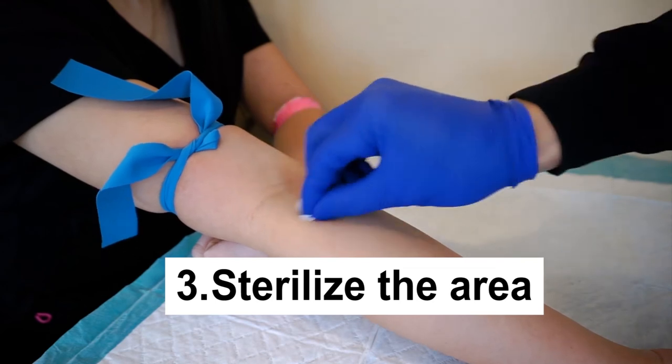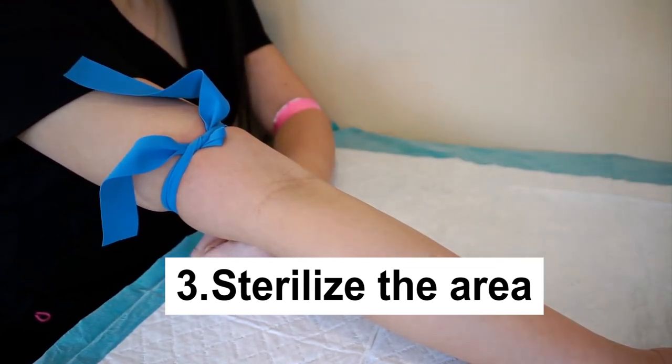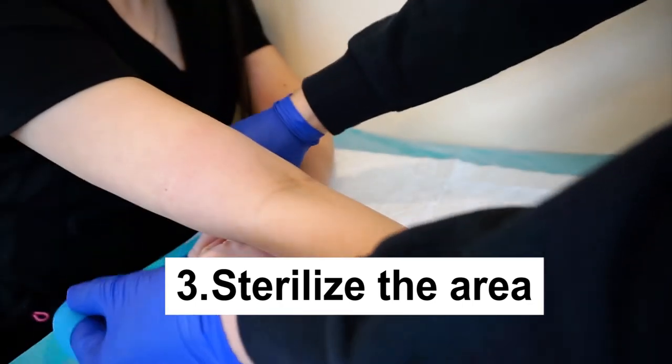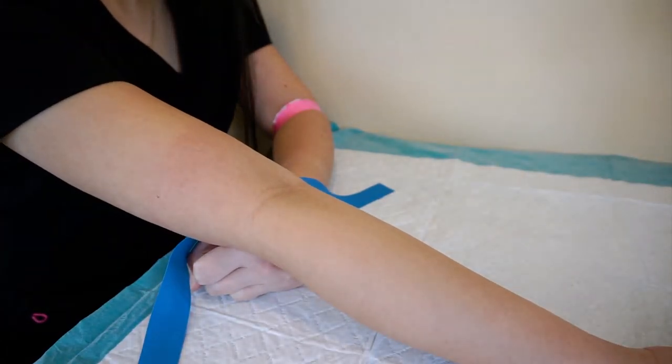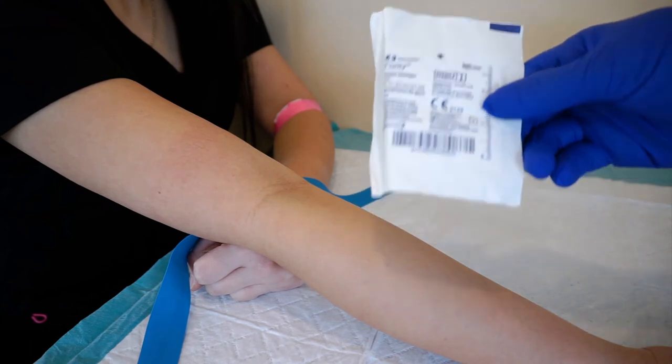Third, sterilize the area by using an alcohol pad in circular motions from inside to outside. If the patient is here for alcohol level testing, do not use an alcohol pad. There are other agents that you can use, such as Chloraprep or iodine.